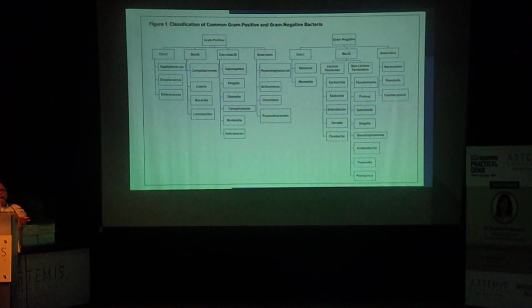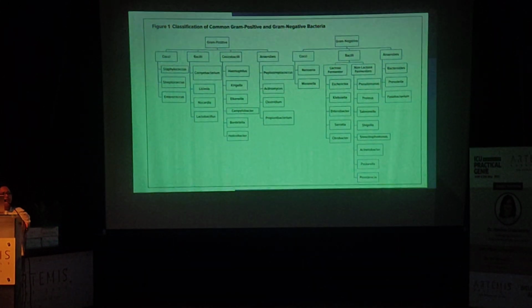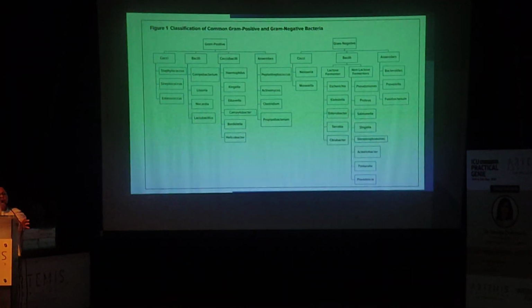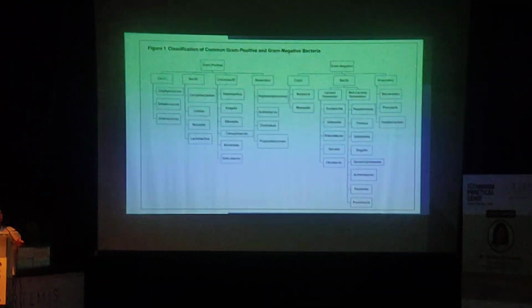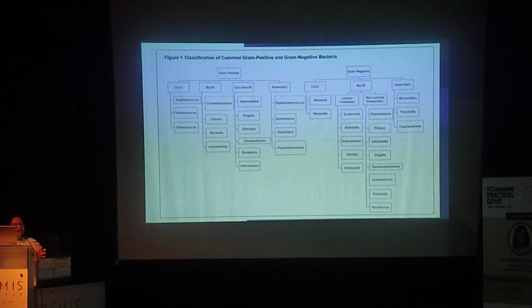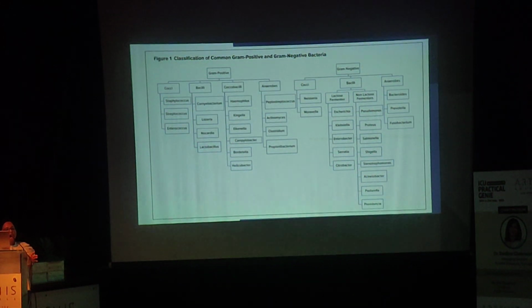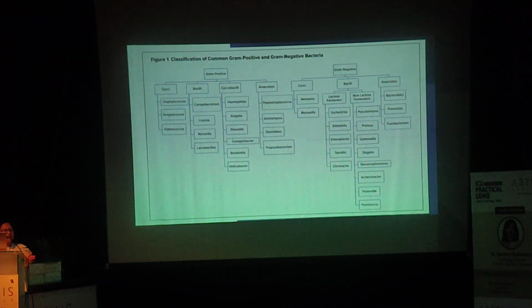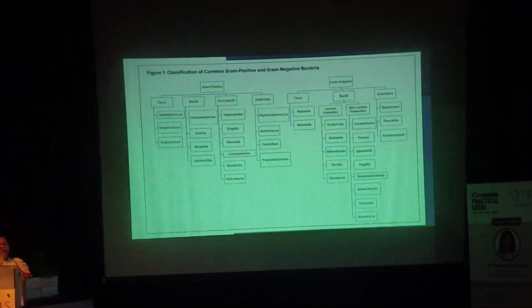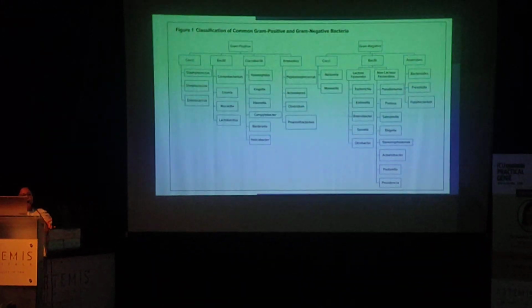So this is a small chart. As we all know, if we are informed that gram positive cocci is there, it can be staphylococcus or streptococcus or enterococcus. If it is gram positive bacilli, it can be Corynebacterium or Listeria. Gram negative coccobacilli consist of Haemophilus, Campylobacter, Kingella, Eikenella. Anaerobes: Actinomyces, Clostridium. These are gram positive anaerobes. When we talk about gram negative cocci, these are Neisseria, and gram negative bacilli are 2 types.